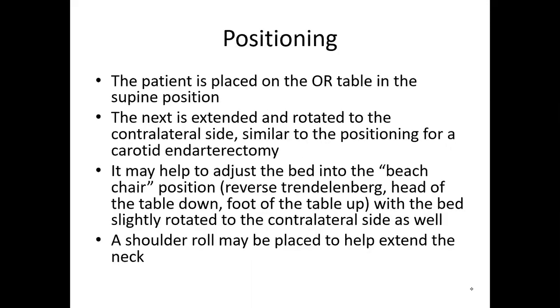So this procedure, most commonly these days, we're doing for the TCAR procedure. The way that I do it, I take the patient to the operating room, place them on the table in the supine position. Similar to a carotid endarterectomy, the goal is to get the neck extended and rotated to the contralateral side. So it helps me to put the patient into a very slight beach chair position, meaning I put the bed in a little bit of reverse Trendelenburg and then tip the head of the table down with the foot of the table slightly up and then rotate to the contralateral side.